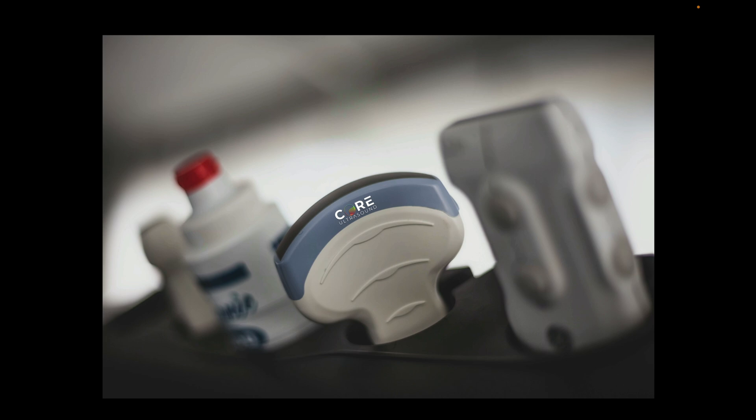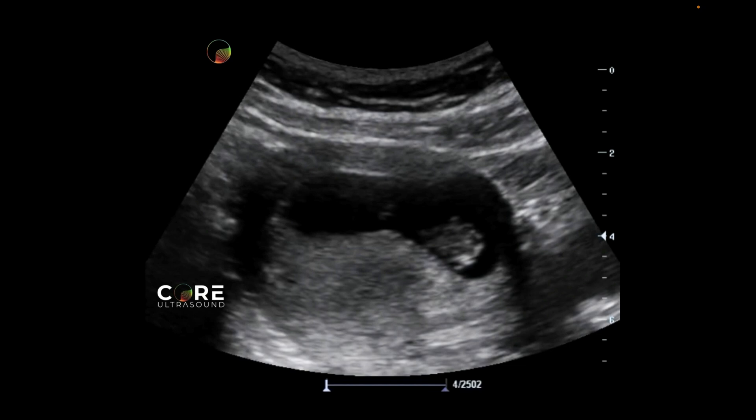Your probe of choice for this exam is going to be the curvilinear transducer. If you can use the curvilinear, that's better, but you can use the phased array transducer in a pinch, and in some situations even the linear transducer, and I'll talk about that in a bit.